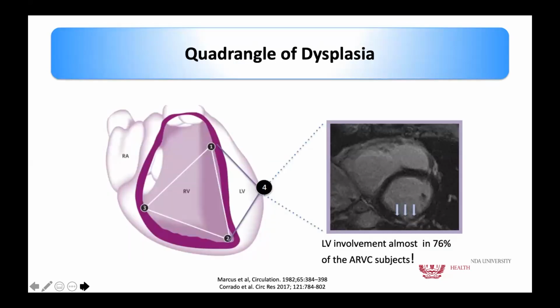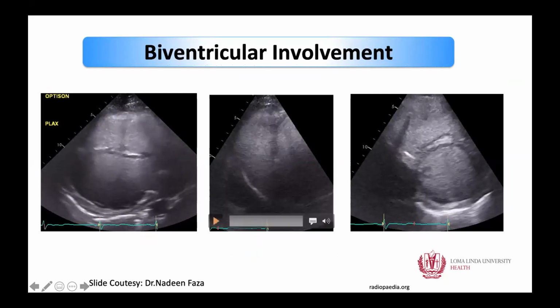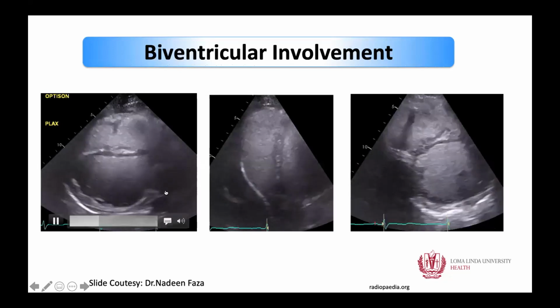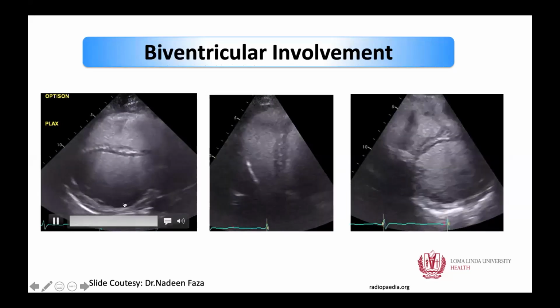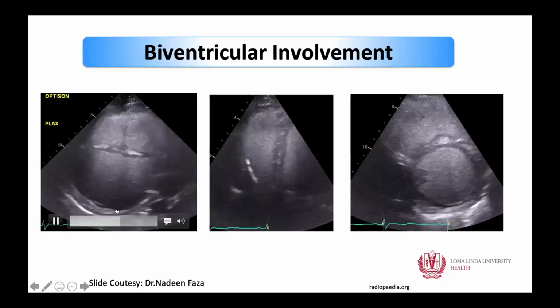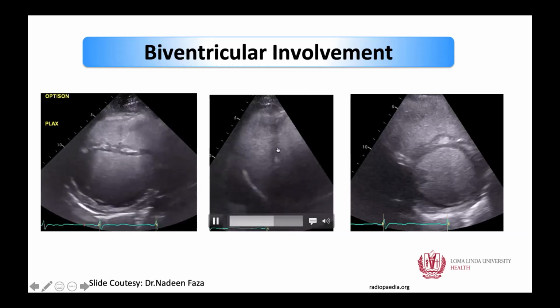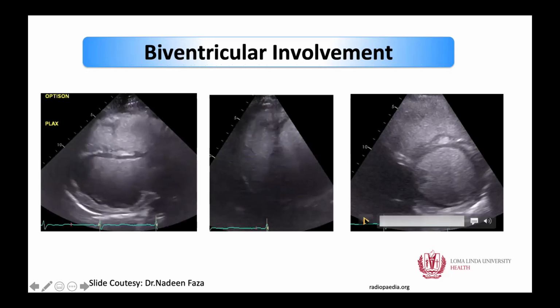And now, in the latest literature, a paper in 2017, that triangle of dysplasia has been expanded into a quadrangle of dysplasia to include the LV findings, because that's the area that typically gets involved in patients with biventricular involvement. So this is an echo finding of a patient with biventricular involvement. And you can see this mid-ventricular mid-wall enhancement on the MRI. Even on echo, when you give contrast, it's not absolutely normal. This may be that patchy area that we see on MRI, but this is one of the examples I wanted to share with you all.